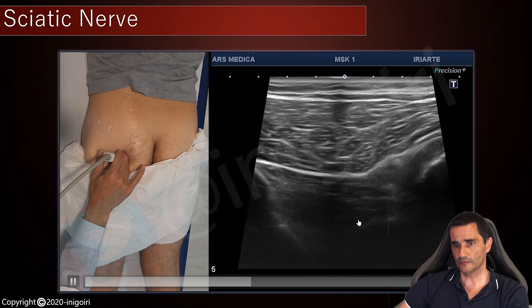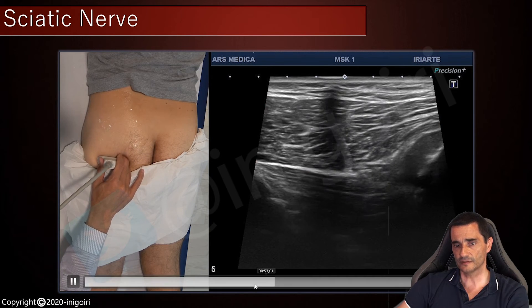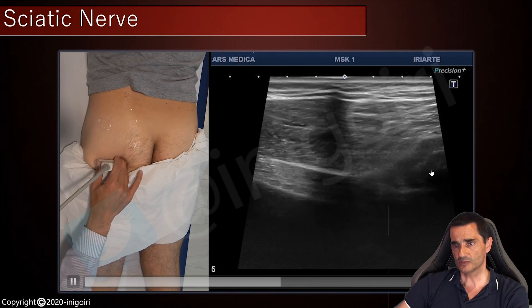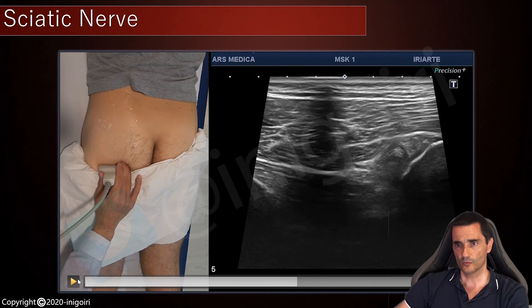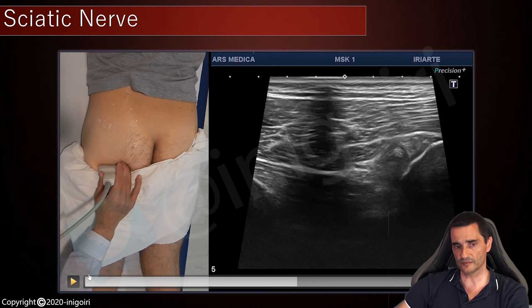If we continue distally, we are at the quadratus femoris muscle. This will be the ischial tuberosity, and the proximal cranial origin of the hamstrings. As we go distal, we will have a better view of the hamstrings with its two components: the superficial one will be the common tendon of the biceps femoris and semitendinosus, and the other will be the semimembranosus component of the hamstring's origin. This is the sciatic nerve, and this is the quadratus femoris muscle.